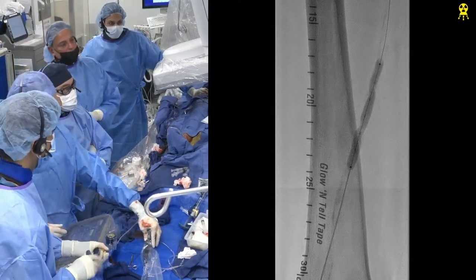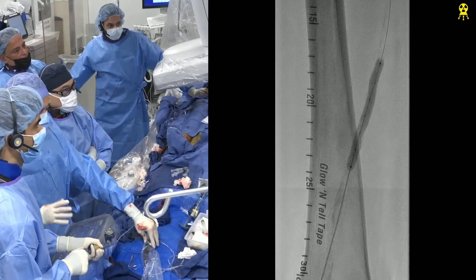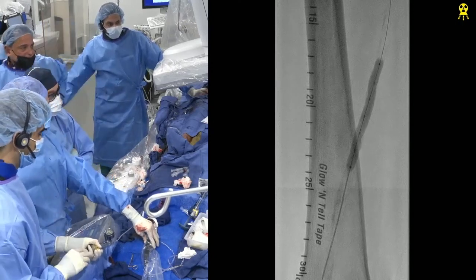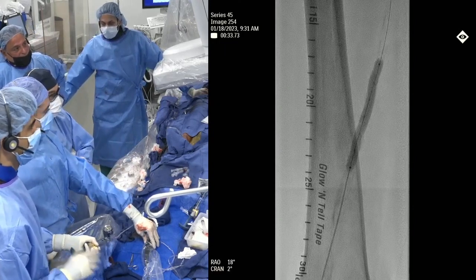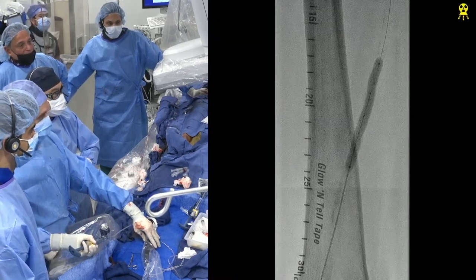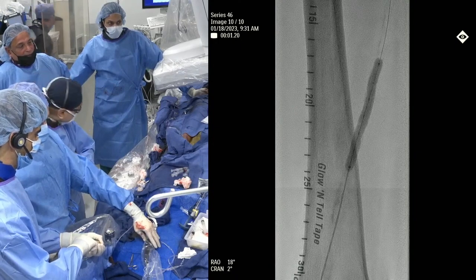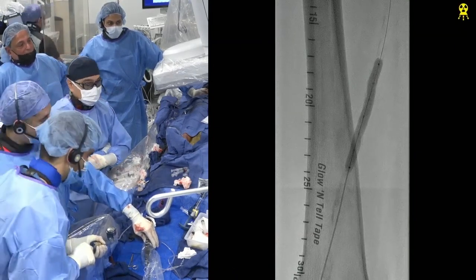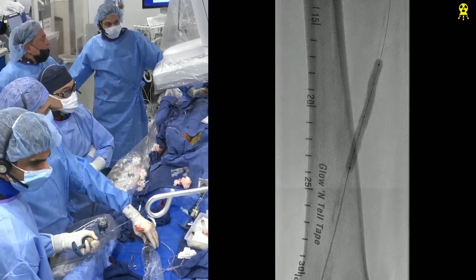Oh, my God. So, PK, what's your next step here after this? You're going to balloon to 6. What size Supera? How are you going to size this? Well, what I'm concerned about now, Srini, is that we have through and through access and are having so much trouble pushing the shockwave up. So now the question becomes how are we going to deal with that common femoral? So obviously get a new shockwave balloon and then try to get the shockwave up. I just don't think it's going to go. PK, if I put a stent here, Srini, the problem is going to become, God forbid, will the shockwave track up through the stent? I don't know.